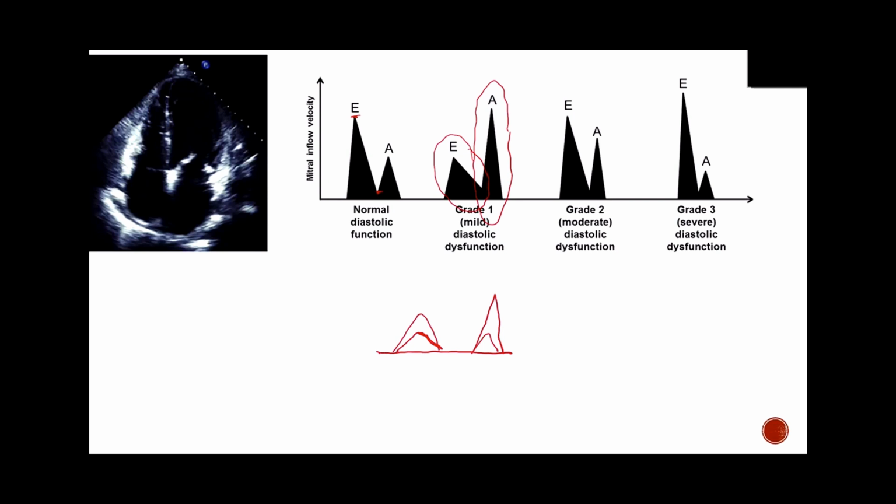Later, what will happen is your left atrium, when it's seeing chronically high pressures with high volumes, is going to hypertrophy. And you're also going to have increased left atrial pressure because of the amount of volume within that chamber over a period of time. And so that gradient between the left atrium and the left ventricle is restored. Now you have a higher left atrial pressure and a more robust, stronger left atrium. So you're going to have a lot of flow across this mitral valve early because your left atrium now has compensated and become stiff and strong itself. So your E wave returns back to what looks like a normal pattern, which used to be called a pseudo-normal pattern.